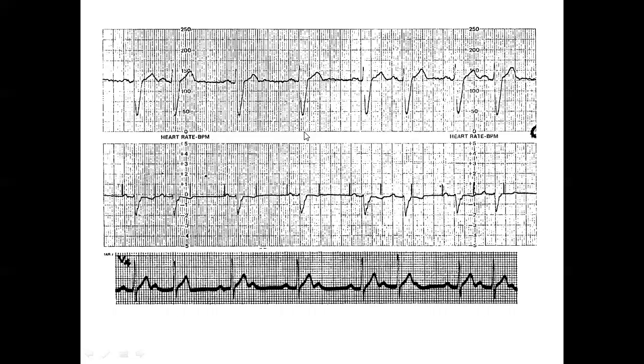Let's see whether I have a diagram. Okay, sinus node is firing here. Sinus node fired here. Took a little longer time to get to the atrium. Then also PR is lengthening. So there's a Wenckebach phenomenon between sinus node and atrium and within the AV node. So dual level Wenckebach phenomenon.